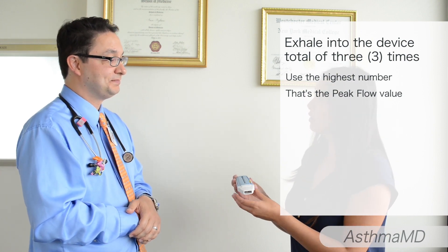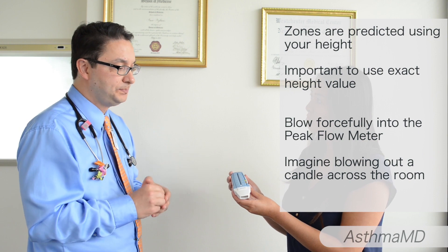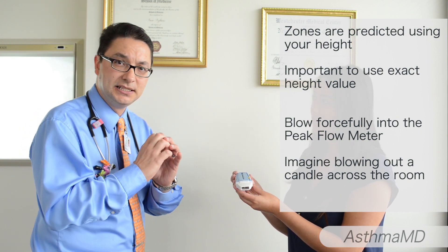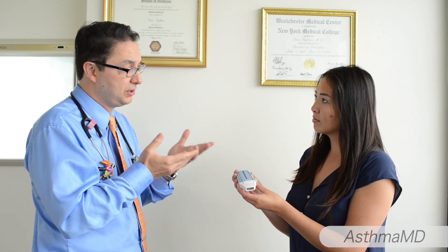Is there anything else we need to be aware of? There are a few things. We do need an exact height measurement to accurately calculate the zone measurements. Also, when you put your lips around the mouthpiece it has to be a tight seal, and you have to blow into the device like blowing a candle across the room. Last but not least, asthma is a chronic condition, so it is important to use the peak flow meter frequently, especially if you're going through medication changes, you're symptomatic, or for example in the evenings.